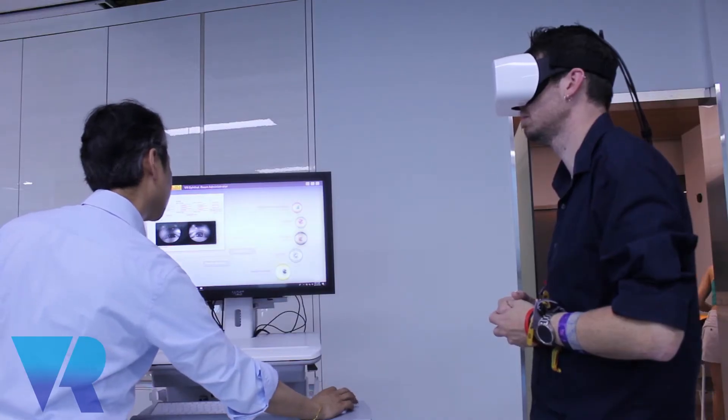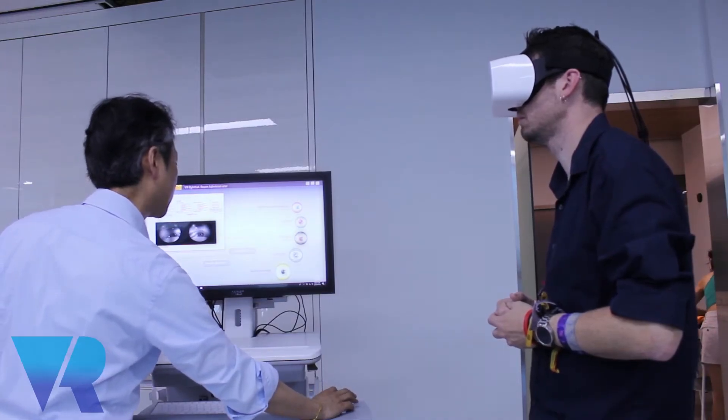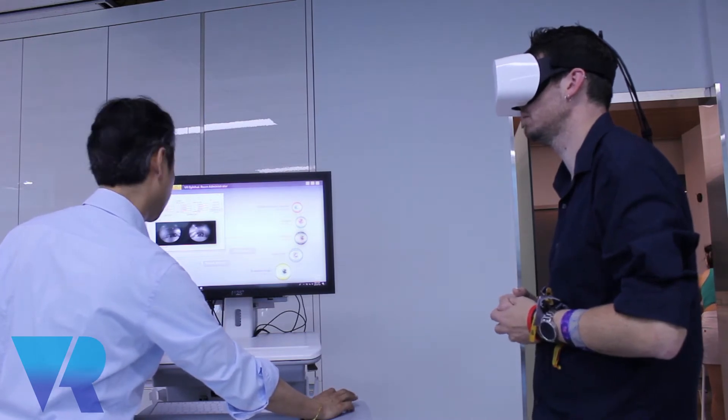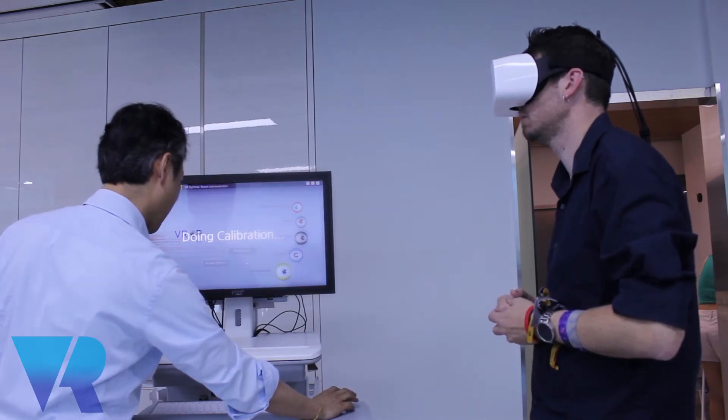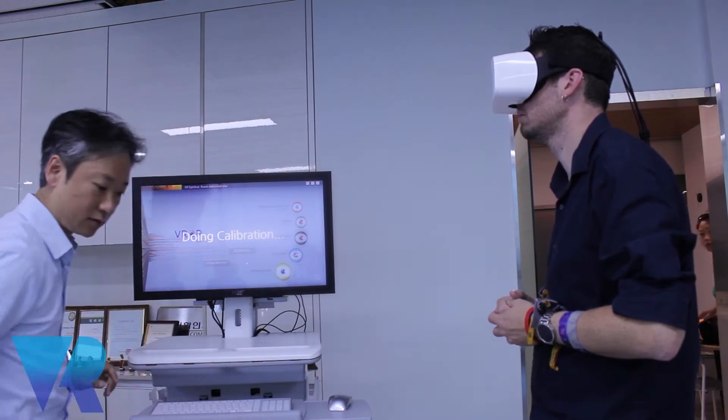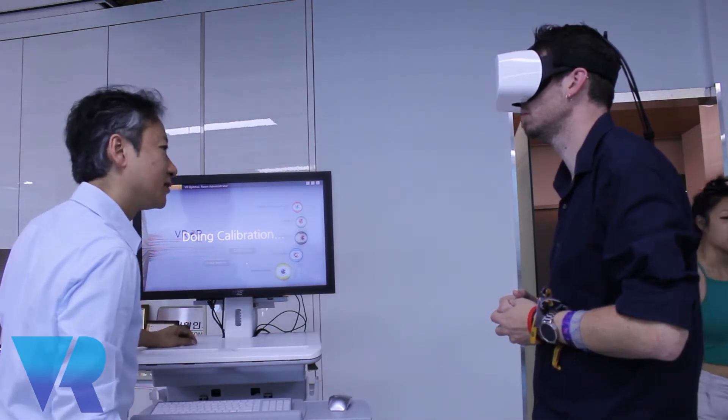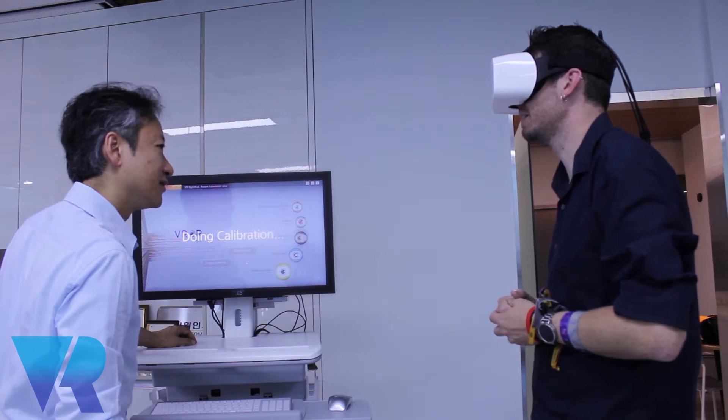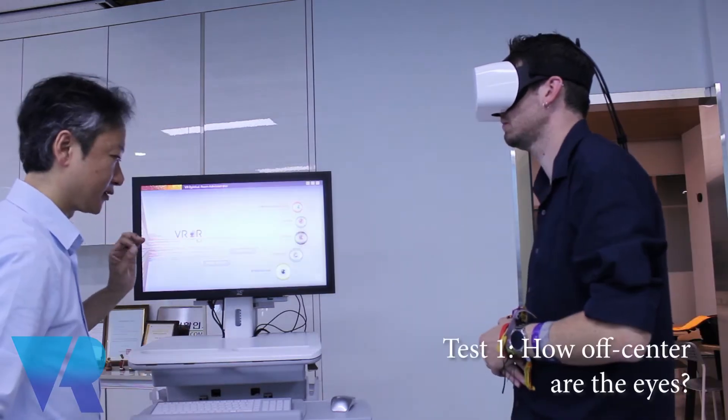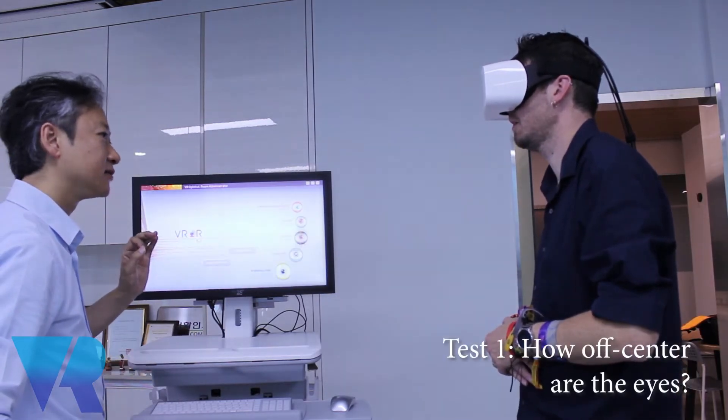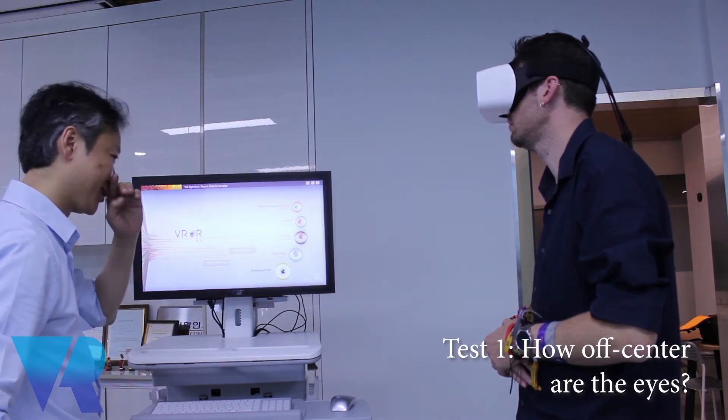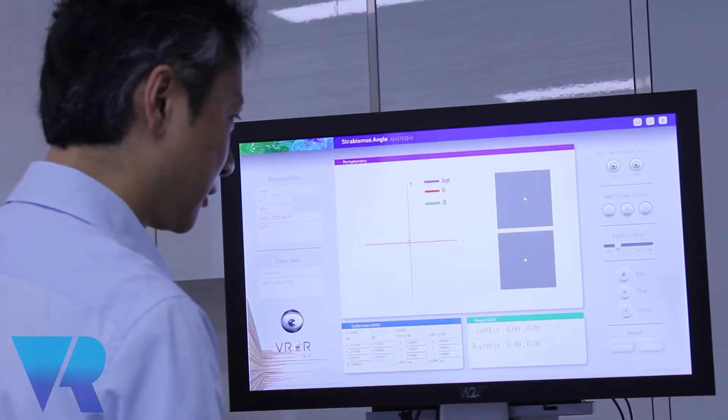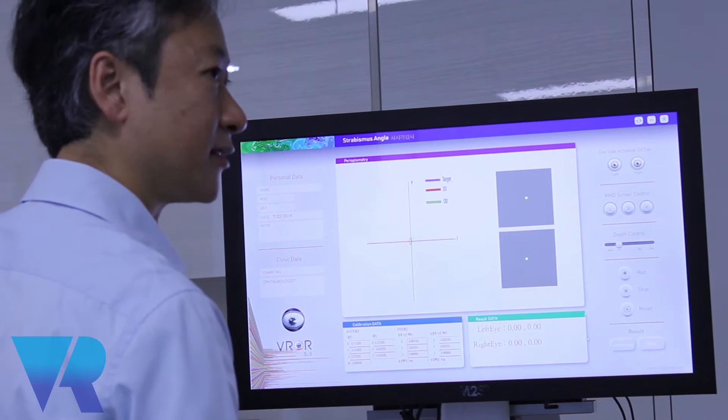Before we do the test, we are going to do the quick calibration so that your eyes can be tracked properly. Could you just take a look at the green dots? I've done this calibration test before. Great. Take a look at the yellow dots. Just stare at the yellow dots consistently. It's going to take around 20 to 30 seconds.